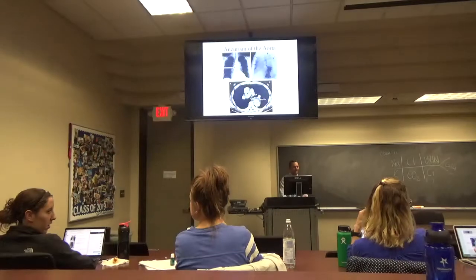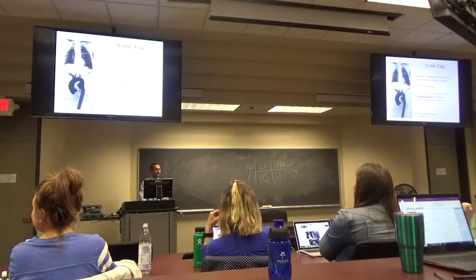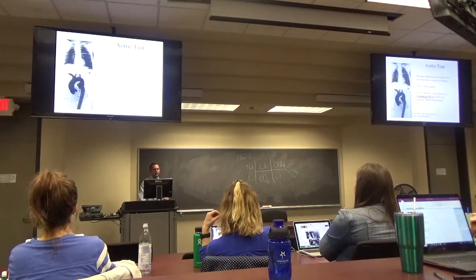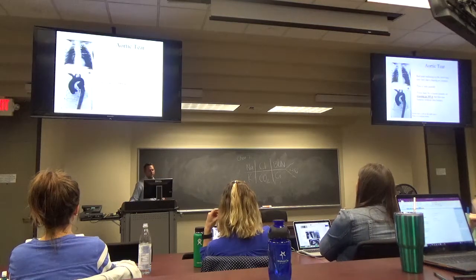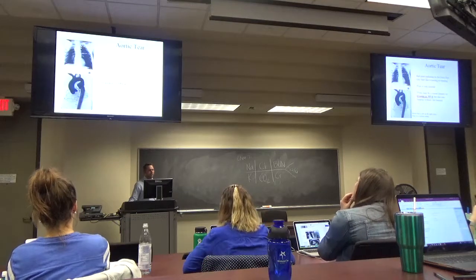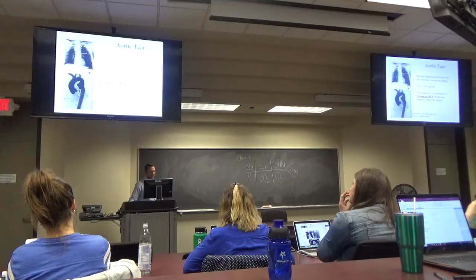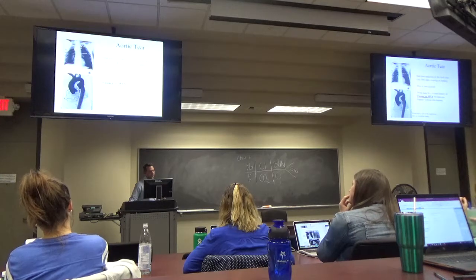So that picture right there, is it actually out? This one, I'm not 100% sure. I didn't get this from theirs. This looks more like a pouch. It doesn't look like it's leaking right now, because you see a little bit of extravasation right here. So yeah, it is. Never mind.